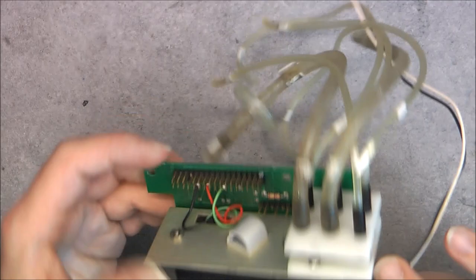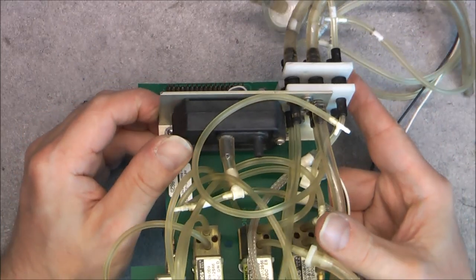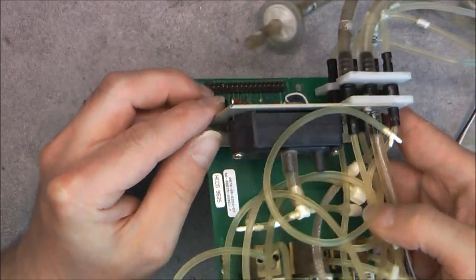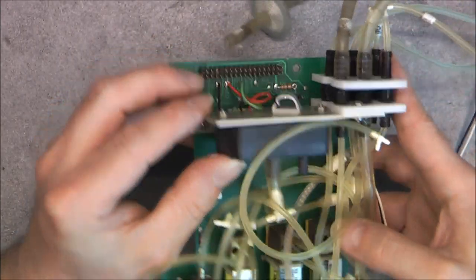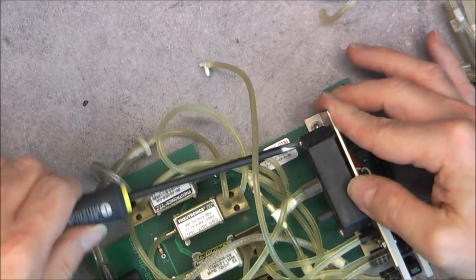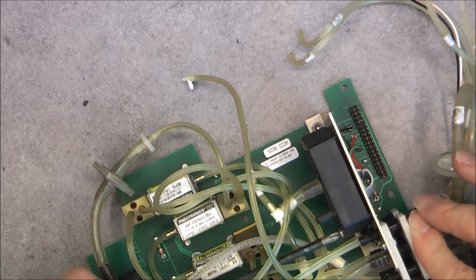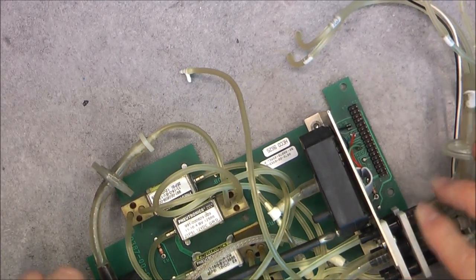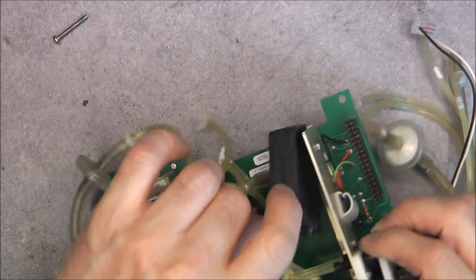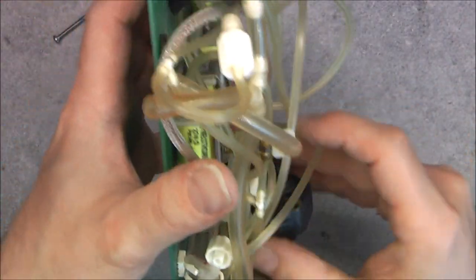And here we have one other device. $400 pressure sensor from Micro Switch. Very interesting. I will show you the model number. Anyways, everything is coming apart, so I will desolder here. You can see the wires to the sensor are soldered to the board. As it is something valuable, I will unsolder them properly. But here is the model number for you.